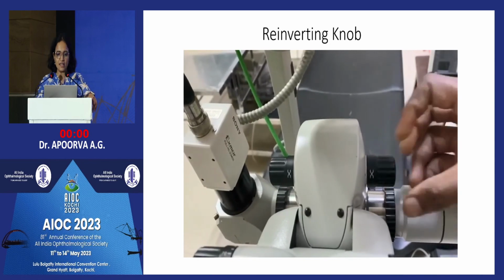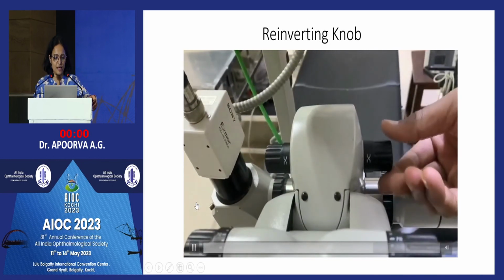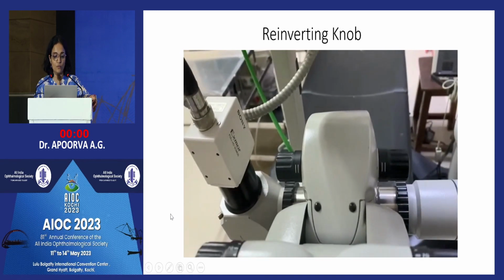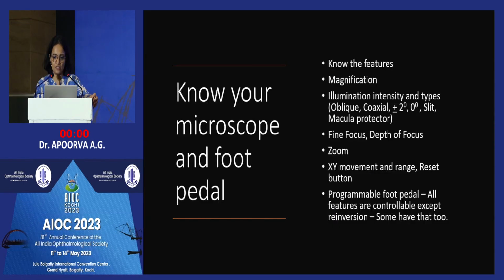So this is a re-inverting knob. This is especially useful in VR surgery, where you use an inverter to do retina surgeries. So this is usually what an assistant does for a VR surgeon.